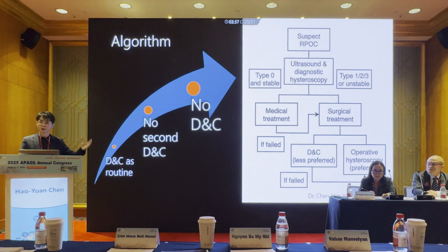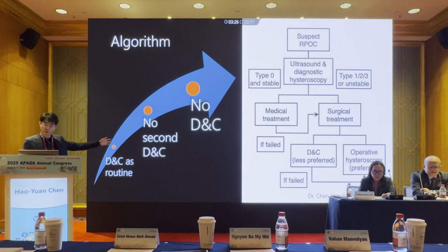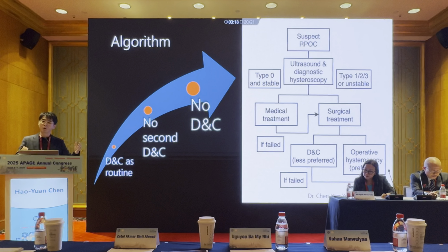As a gynecologic endoscopist, I believe that our ultimate goal is to abandon DNC altogether. But this paradigm shift is going to take time. I believe we are somewhere in the second stage over here. So I would like to invite all of you to endorse this no second DNC policy. Just imagine if you perform a second DNC on an RPOC patient.